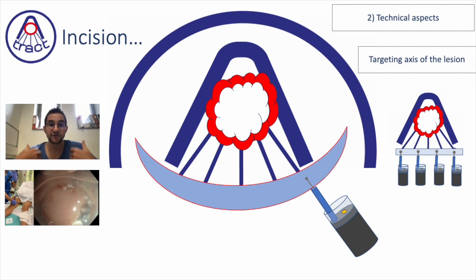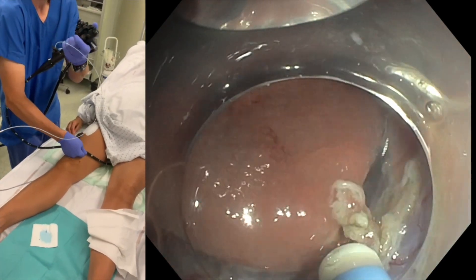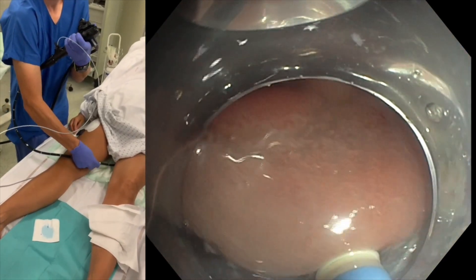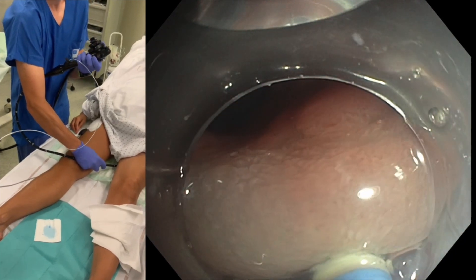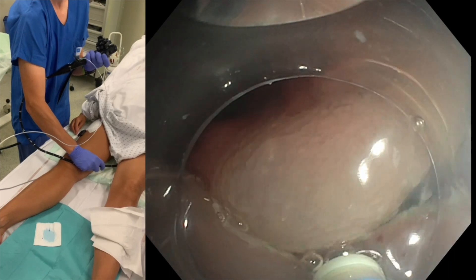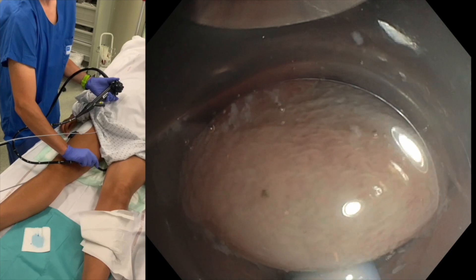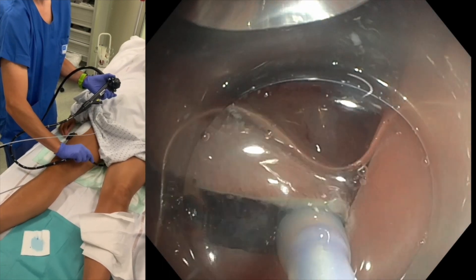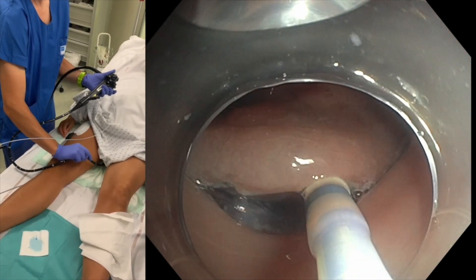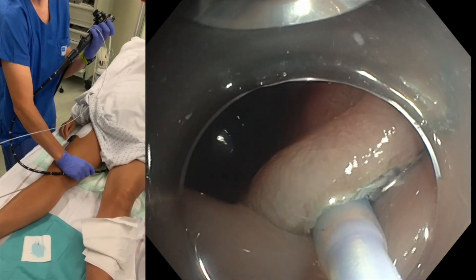If your knife is not oriented to the center of the lesion, it is less effective because it doesn't participate in the ESD of the targeted area. In practice, you will have a complex movement: turning, rotating the scope, and rotating the angle to always have the knife going to the center of the lesion so that it participates in the ESD.